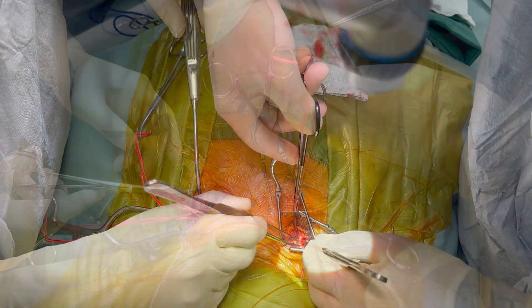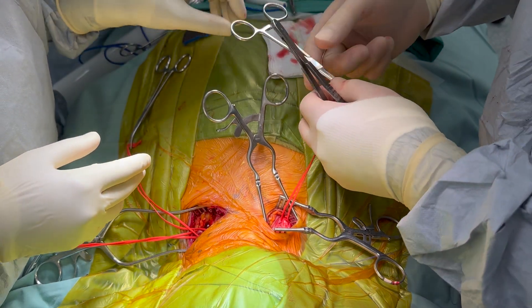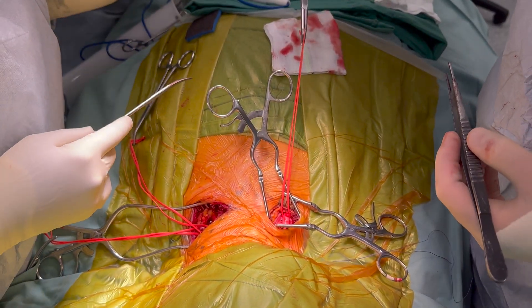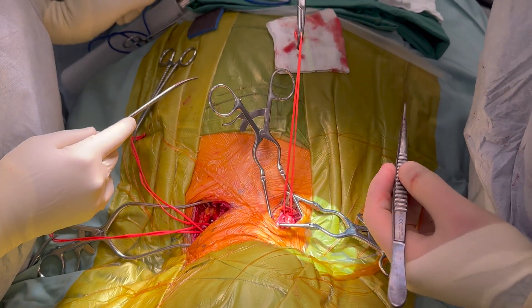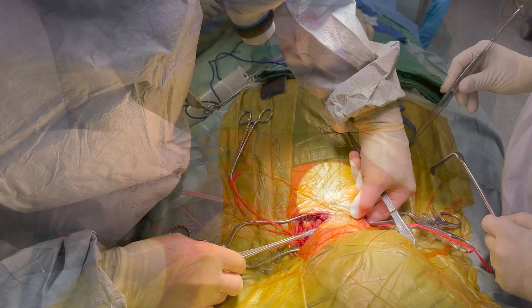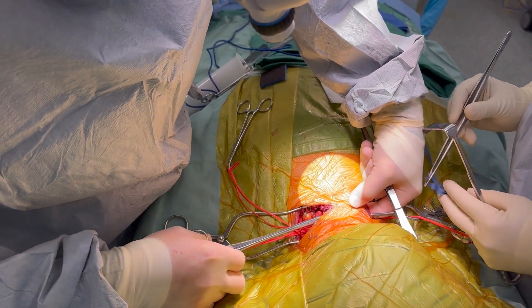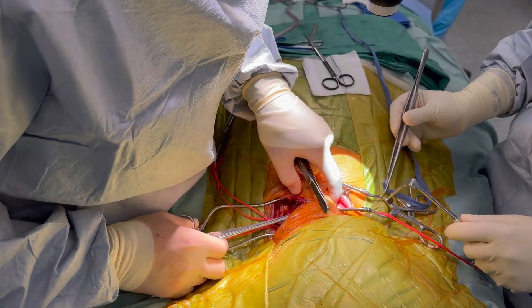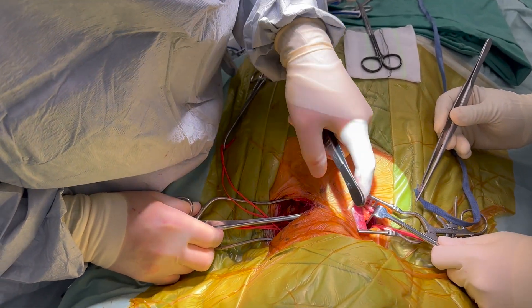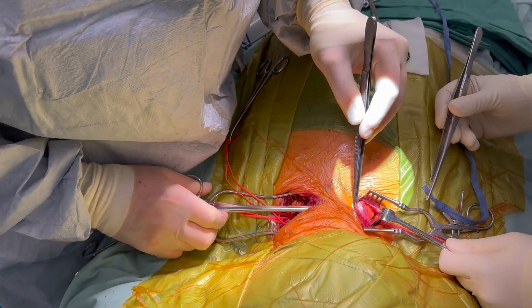There's the carotid artery. For heparin dosing, we give the standard 100 units per kilo, or 5,000 units usually — a homeopathic dose compared to the cardiac surgeons. The tunnelling plane is between the strap muscles and the thyroid, avoiding going through the trachea and thyroid.